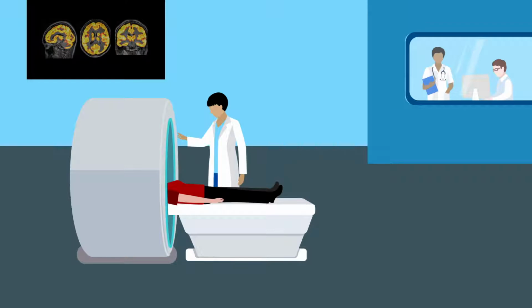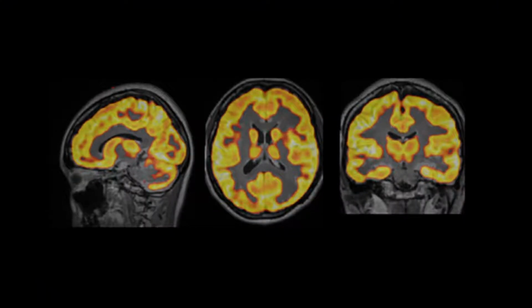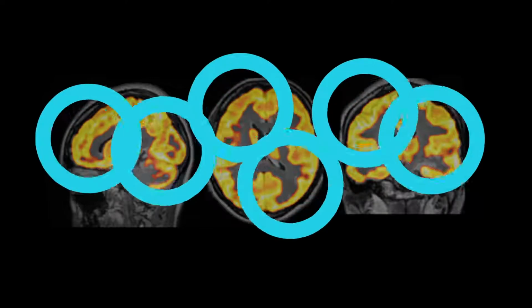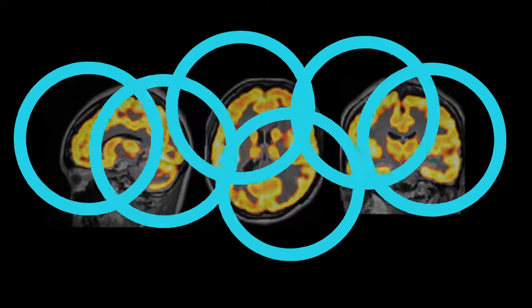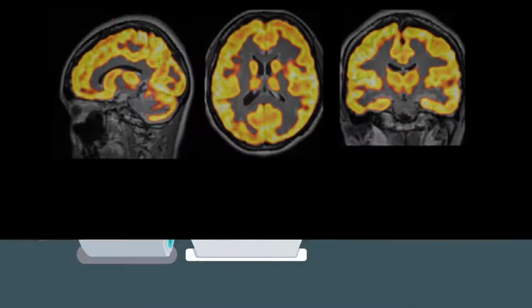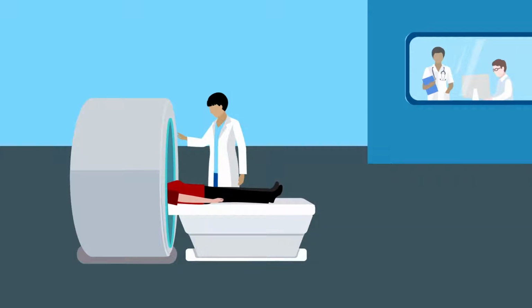The most obvious application of this procedure is improving the MR-PET diagnostic accuracy of diseases and monitoring their progression and response to treatment. But it will also help researchers understand the basic science that underlies normal brain activity. The physiological pathway of the PET tracers can be monitored as they participate in metabolism, and local and global structural and functional information about the brain can be measured by MRI. Using a hybrid MR-PET scanner, researchers could therefore gain a better picture of complex brain physiology and metabolism.